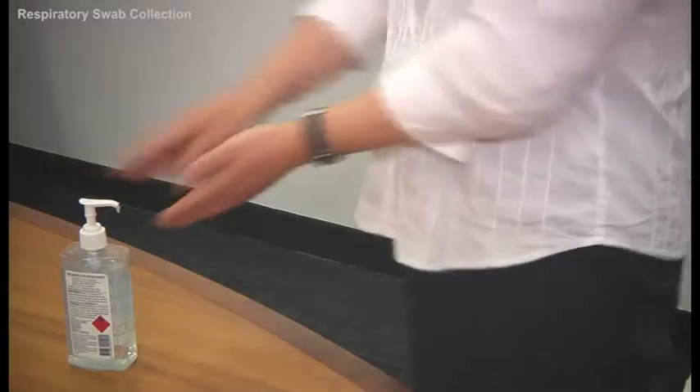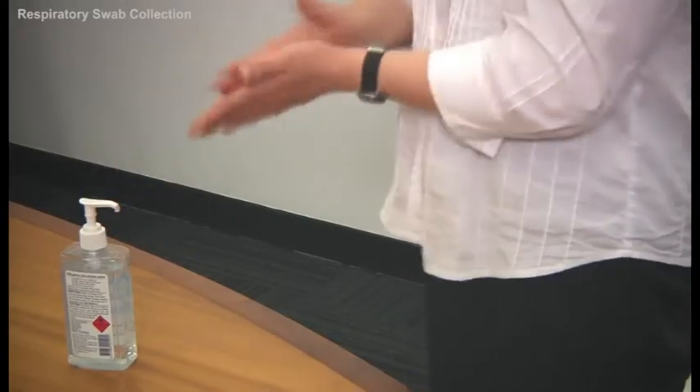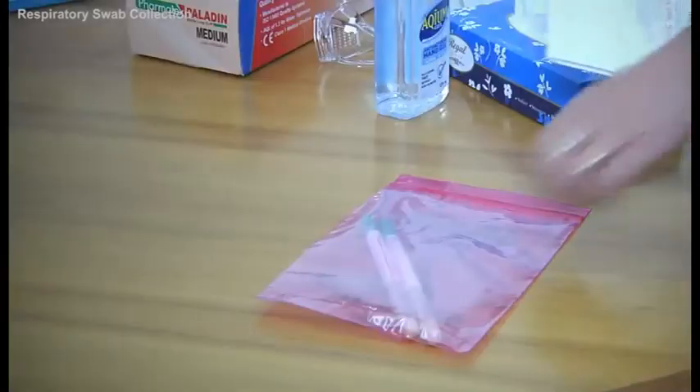Then perform hand hygiene. Finally, arrange for transport of your specimen to the laboratory.